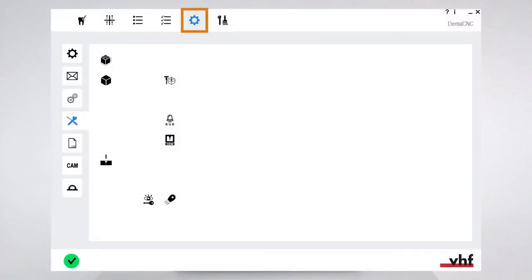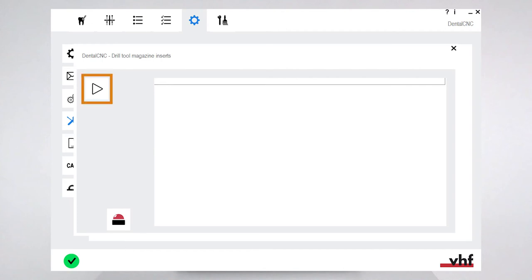Open the Dental CNC application settings and open the machine maintenance view. Select the function "drill tool magazine inserts" and start the drilling process.